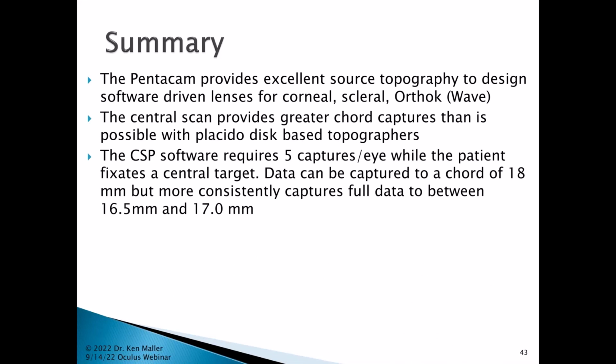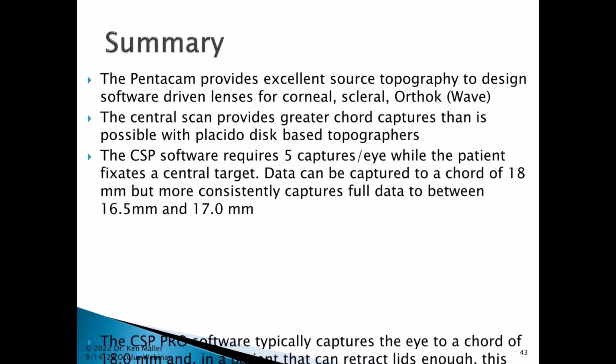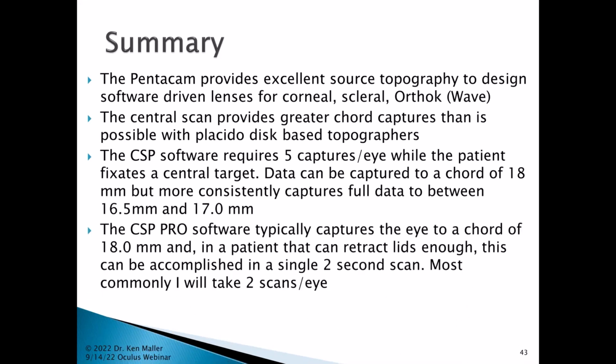The CSP software requires 5 captures per eye while the patient fixates a central target. That data can be captured to a chord of 18 millimeters, but more consistently, I found the captures of full data to be somewhere between 16.5 millimeters and 17 millimeters. On the other hand, the CSP Pro software typically captures the eye to a chord of 18 millimeters, and if the patient can retract the lids enough, this can be done in a single capture. The single capture is about 2 seconds worth of time, so it's very nice.